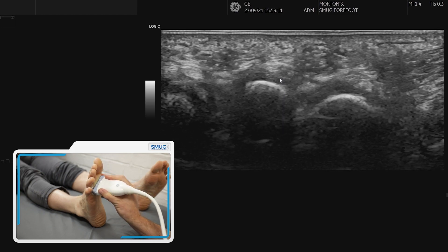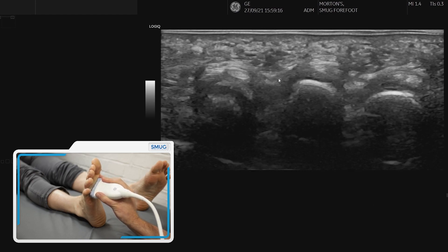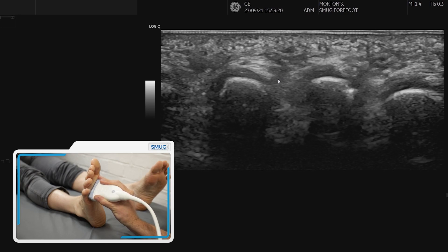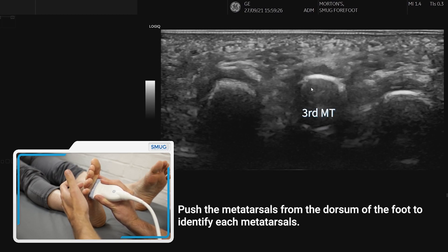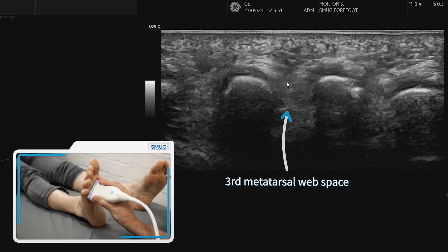Most Morton's neuromas are between the third and fourth toe in the third web space, so we need to be sure that we're on the right web space. We just push from the top — you can see this is the third and this is the fourth, so that space in between is where we need to look.